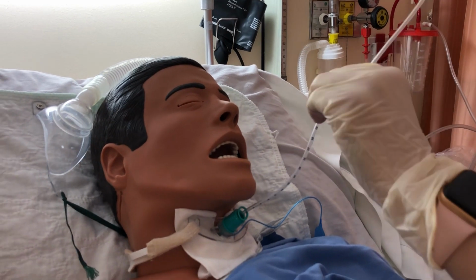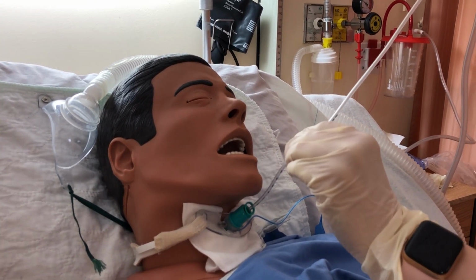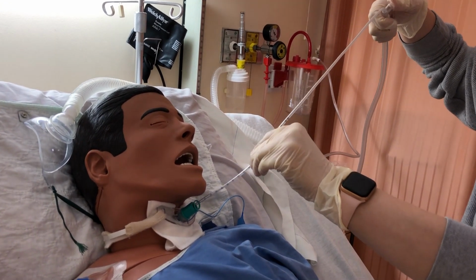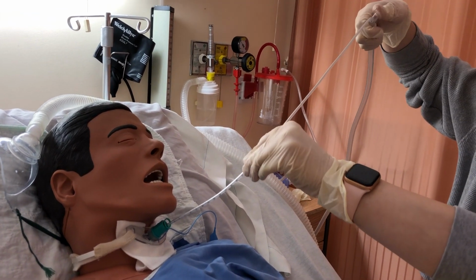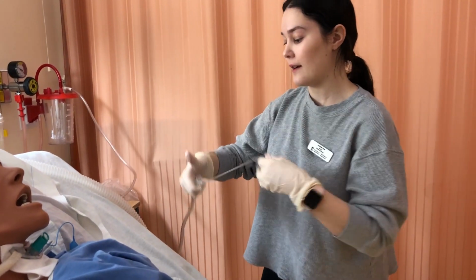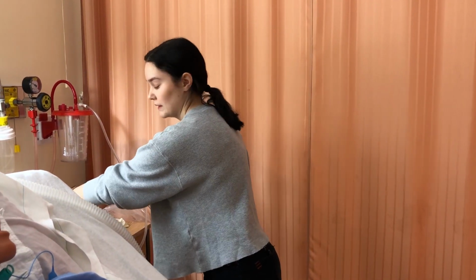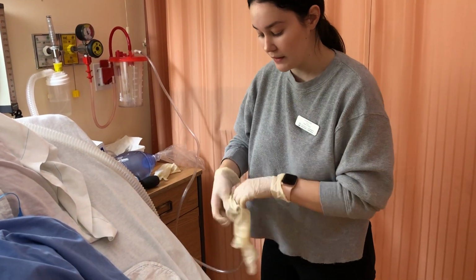I'm going to insert. While I'm inserting, I'm not going to actively suction. I'm going to go until I hit the bifurcation, which I did, and then I'm going to do intermittent suctioning, twisting. And I'm not suctioning for more than 10 to 15 seconds. Now that I'm done suctioning, if I went in for a second pass, I would need a new tube, but I'm not going to go in for another pass. I cleared this tubing with sterile water or normal saline.